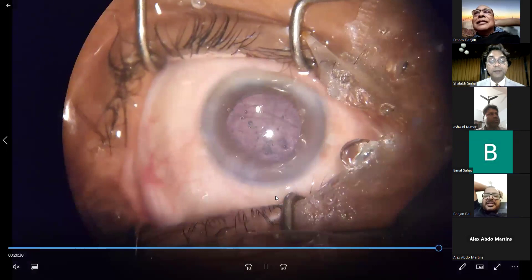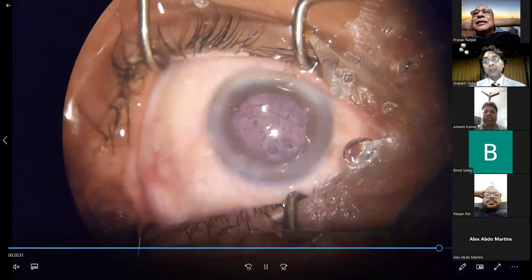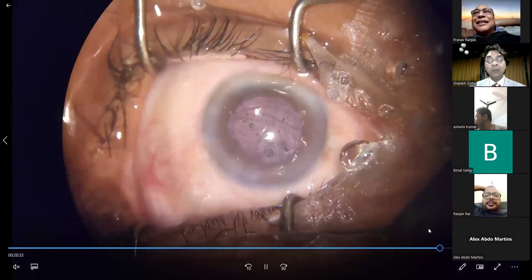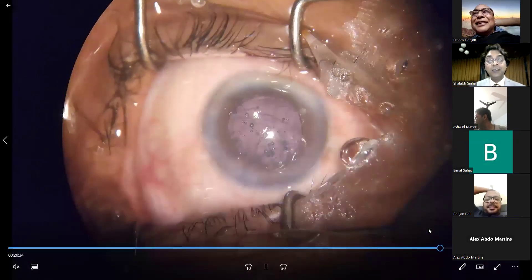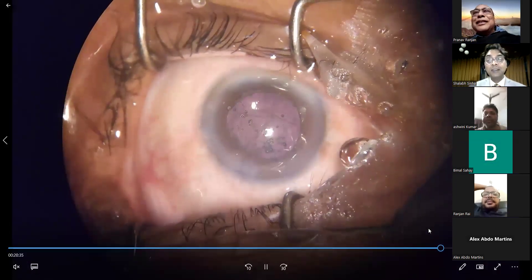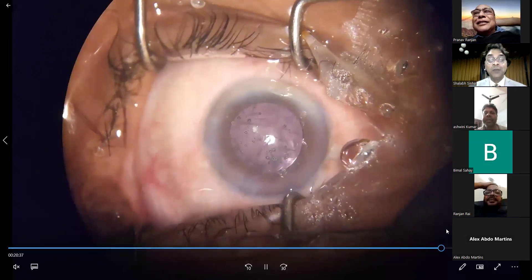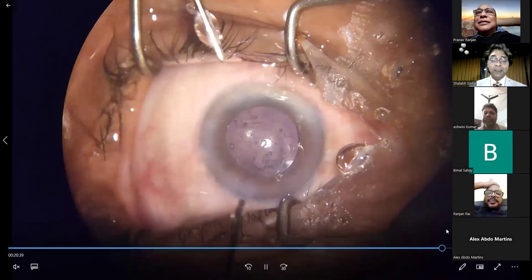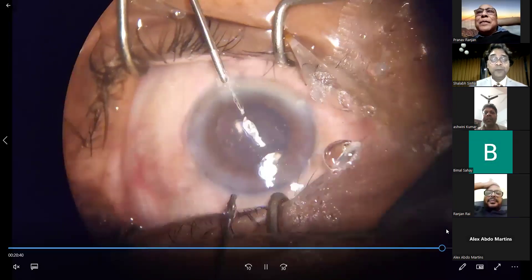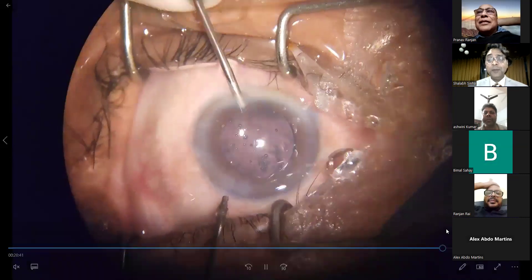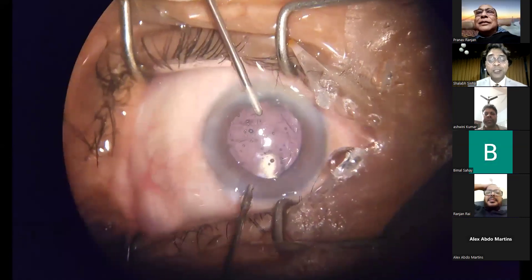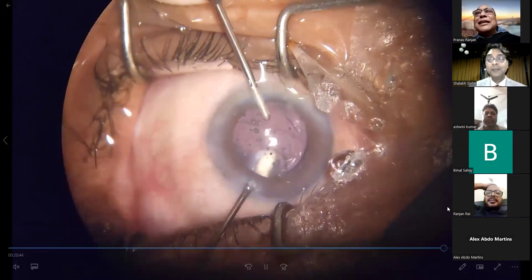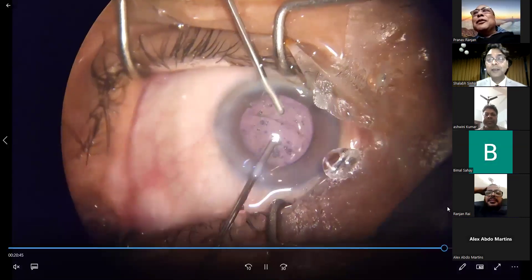Well managed! The lens is now above the anterior capsular margin and the situation is under control.